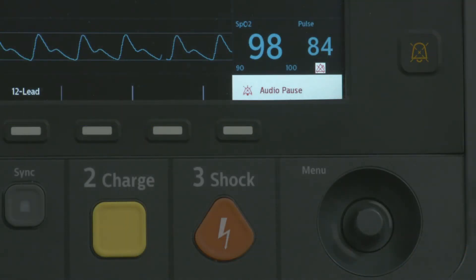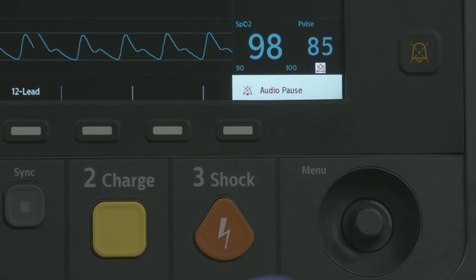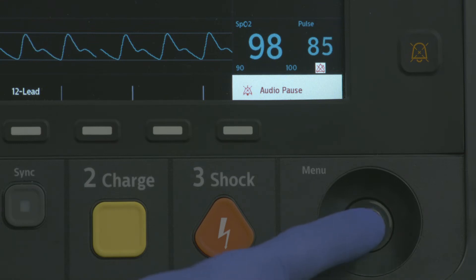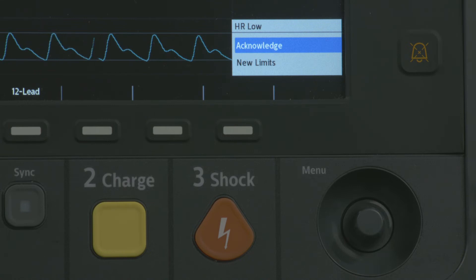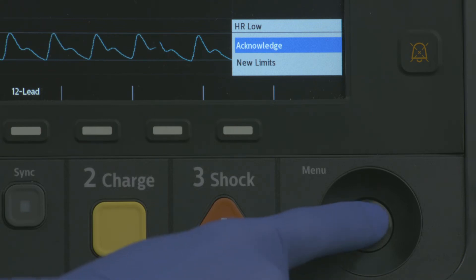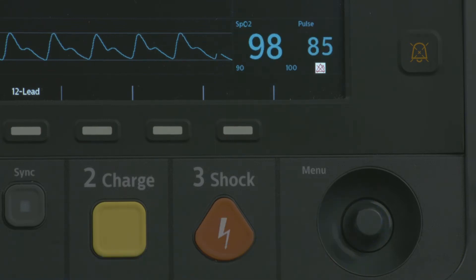To respond to an active alarm, press the SMART SELECT knob once to pause the alarm for the configured pause period while you attend to the patient, and press it again to acknowledge the alarm.